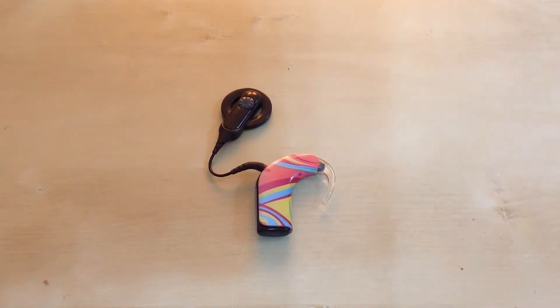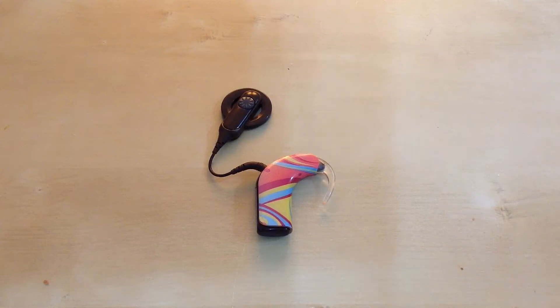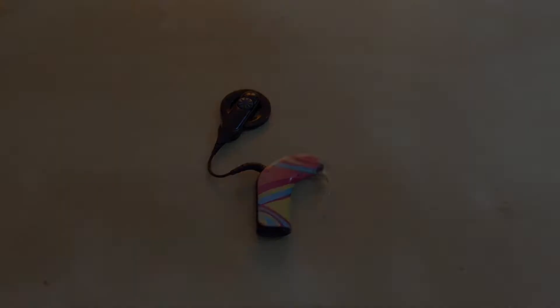Hello guys, what's up? Today I'm going to show you how to turn on and off a Nucleus 5 cochlear implant, and I'm going to show you what the two buttons on it are used for.